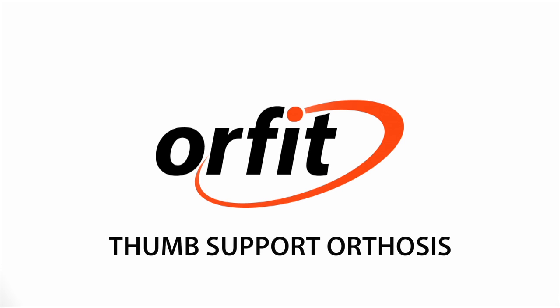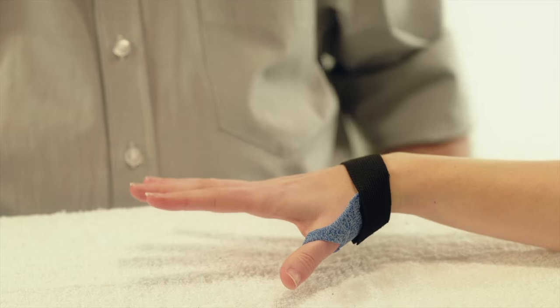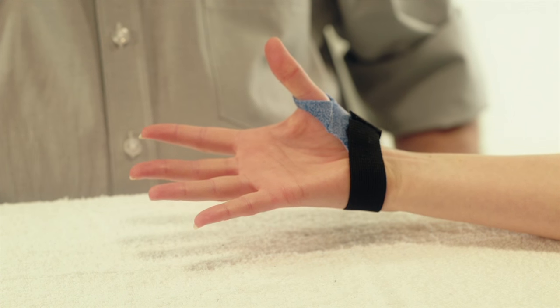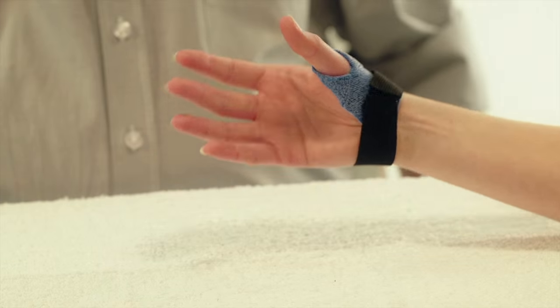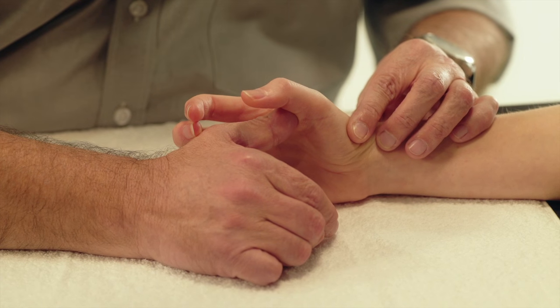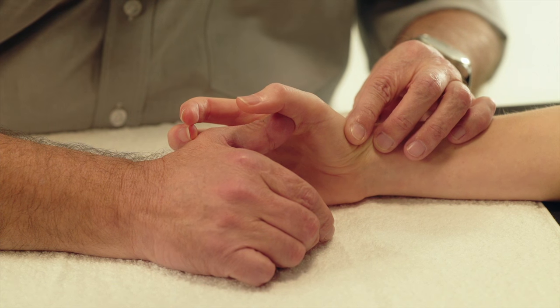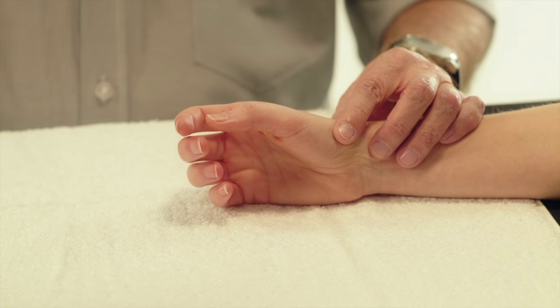Thumb support orthosis. Here we will demonstrate how to make a functional orthosis in case of root arthrosis. The orthosis will exert pressure on the base of the metacarpal bone and bring the thumb in abduction by pushing on the cavity of the first web space.